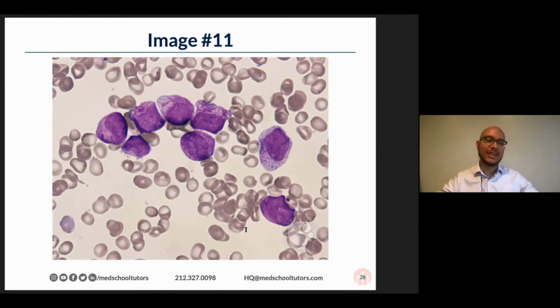So I'm thinking this is an immature leukemia, which means it's either acute myeloid leukemia or acute lymphoid leukemia, AML or ALL. And folks have already pointed out that what we're seeing here in many of these cells are Auer rods, these long, thin, purple staining rods in the cytoplasm. And it is for that reason that we can confidently say that this is an acute myeloid leukemia, because, as folks have been saying in the chat as well, these are made of myeloperoxidase crystals, essentially, right?